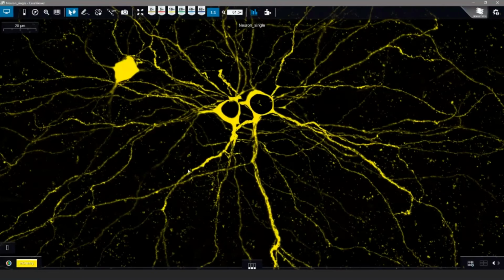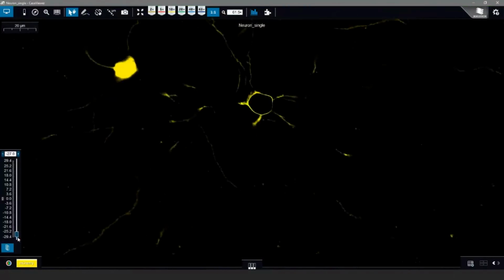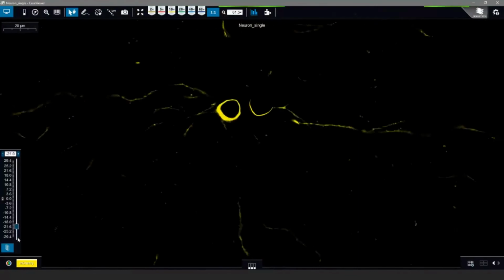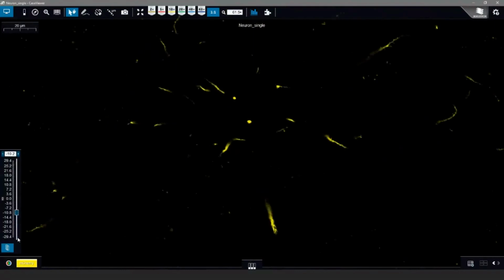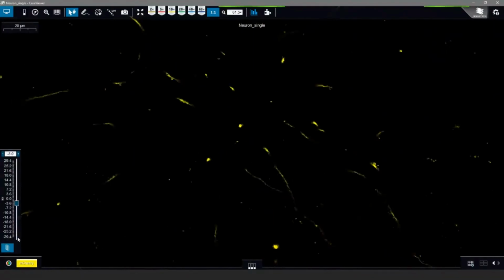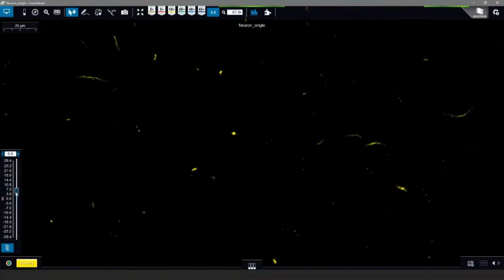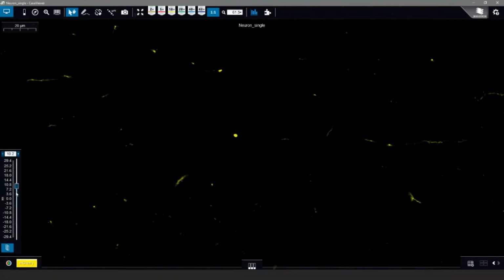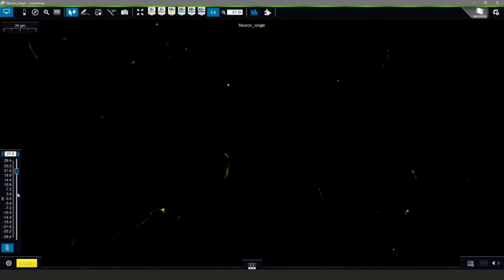Of course, if you would like, you can disable this extended focus view, and by using the scroll button on your mouse, you can change between the different layers of the digital slide, and basically now we see the image information from layer to layer. Please notice that the changing between these layers is quite fast. I hope that the WebEx video can follow my movement fast enough.